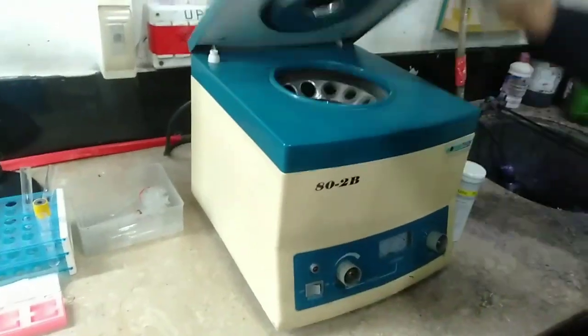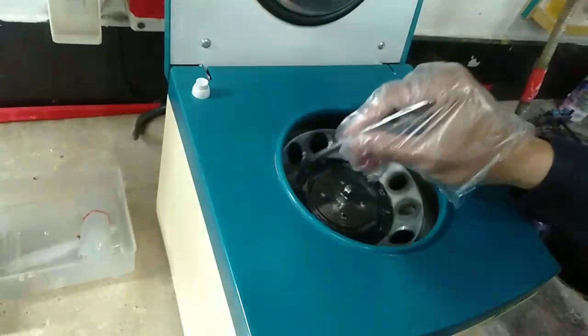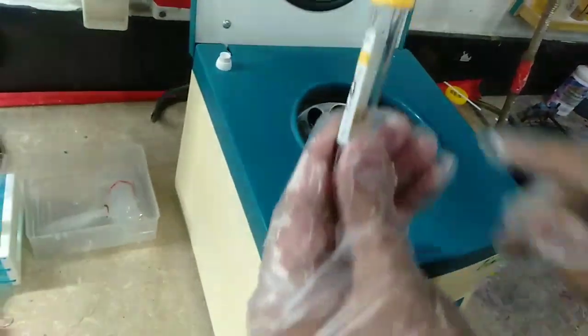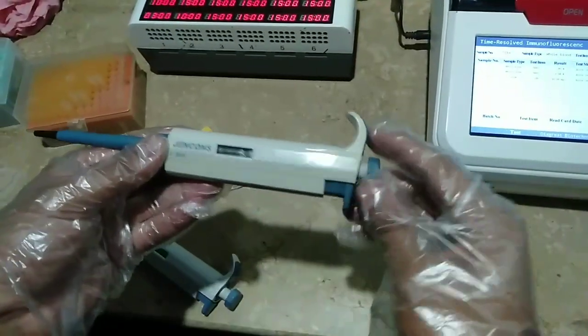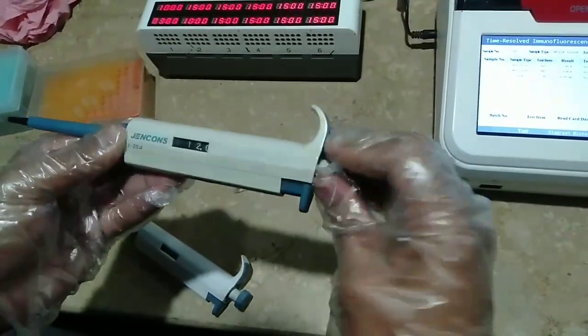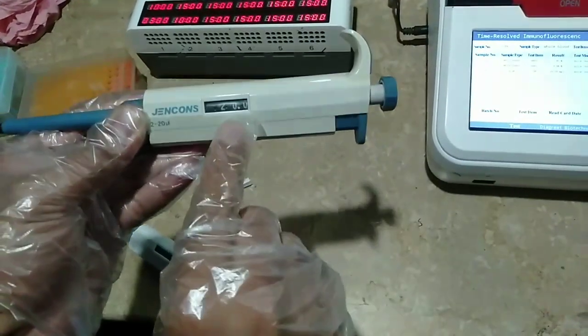After a few minutes of centrifugation, what we will get is serum. So we will turn off the machine, as you can see. Then we will take out the blood — as you can see, this is the yellow portion, which is the serum. Then we will set the pipette to 20 microlitre — so now it is set to 20 microlitre.